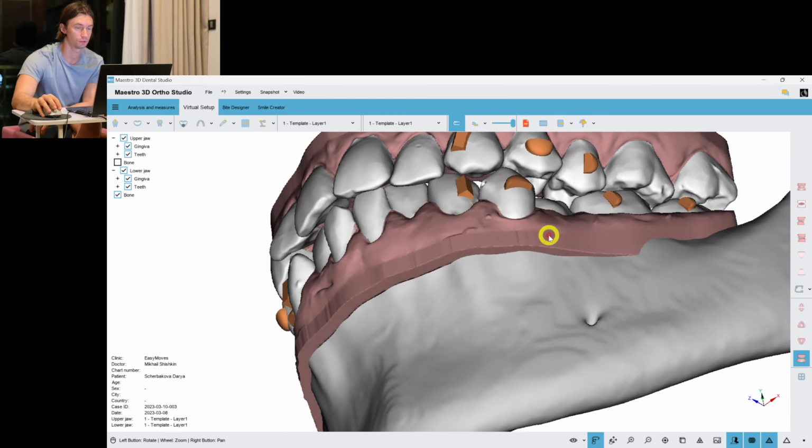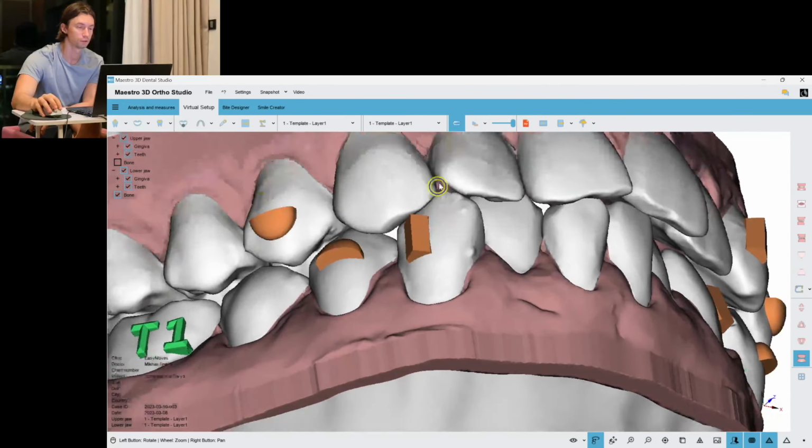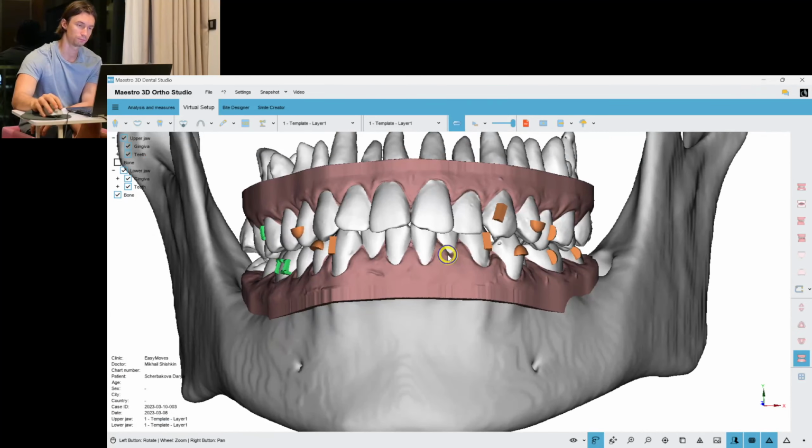And the final check attachments, if there's some bite. I think no, it's closed, but now it's fine.